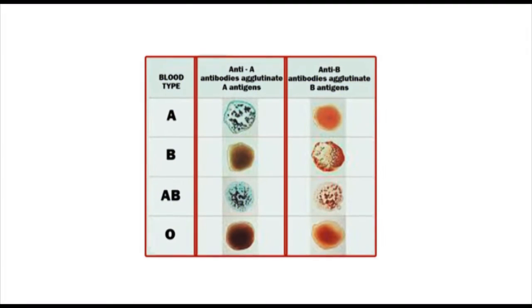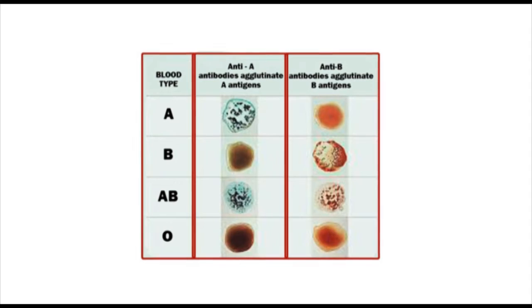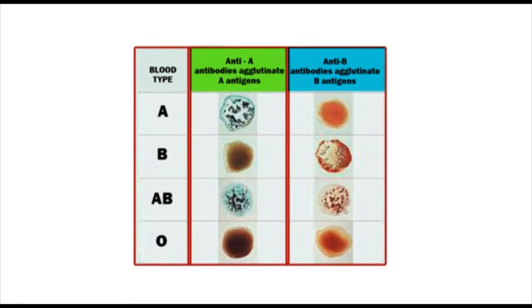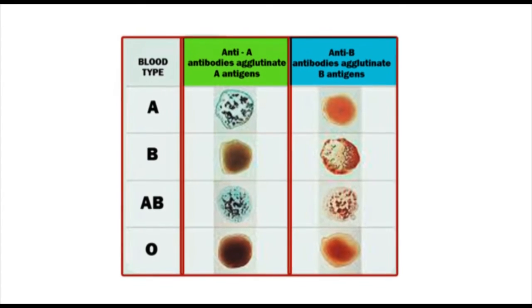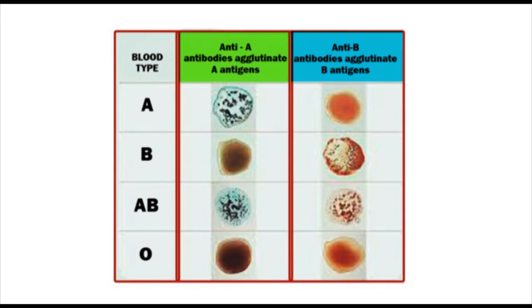For blood typing, a drop of blood on a slide is mixed with antisera against antigen A and antigen B of blood groups. The antigens present on the surface of the RBCs will interact with the specific antisera and clumping or agglutination will be observed. If there is no antigen present in the blood sample, no clumping will be observed and it will be interpreted as having blood group O.